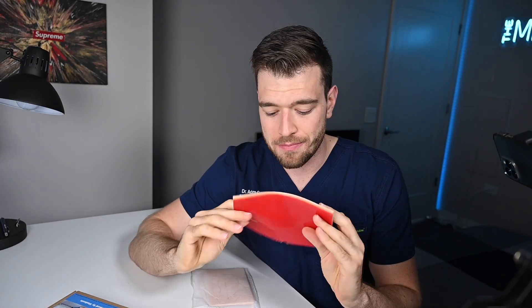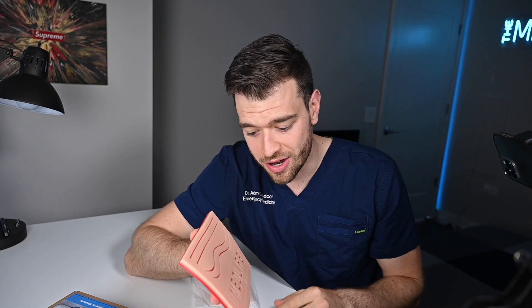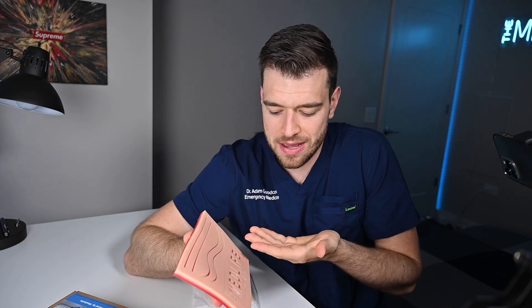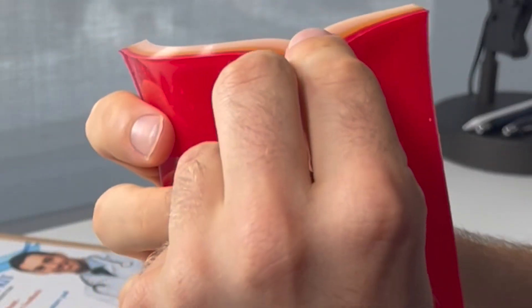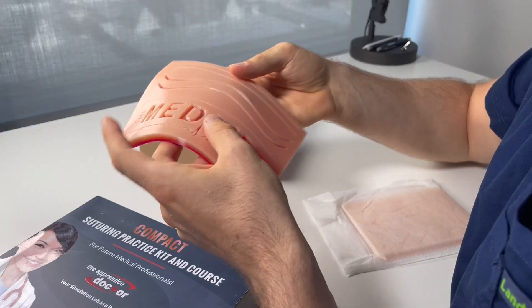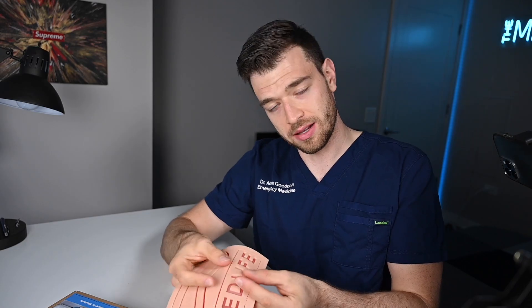To be fair, my suture pad is the custom one. Full disclosure — we had it made for us, it's got our logo on it. I really like this one; it was made to my specification. It's got three layers: a nice thick skin layer, a fat layer, and a blood layer down below, and different types of wounds that you can repair. You've seen it all over my social media.